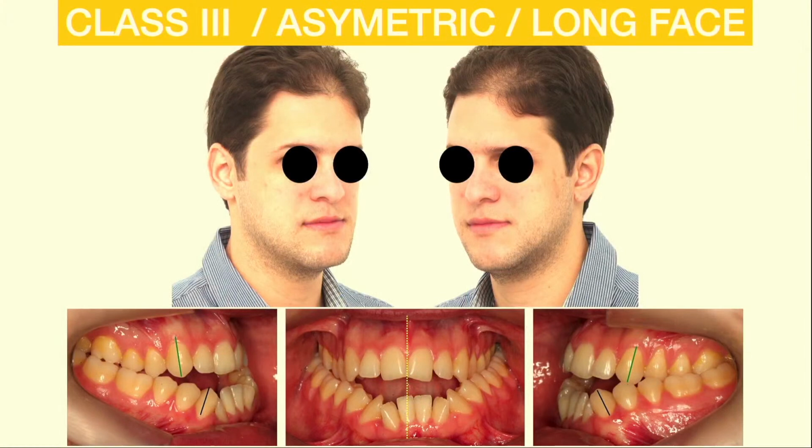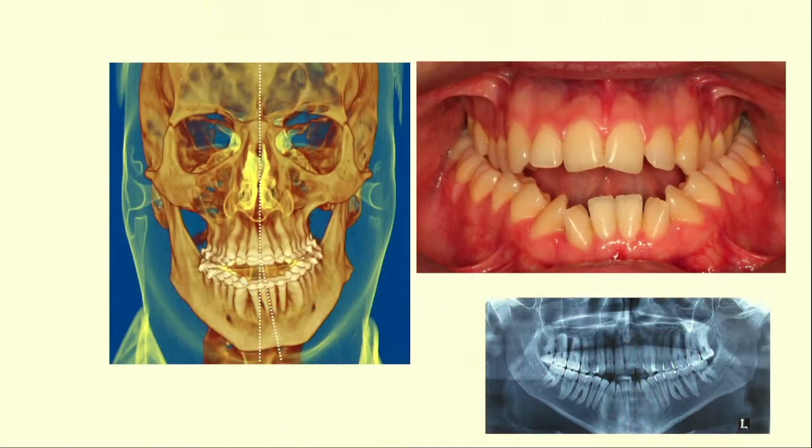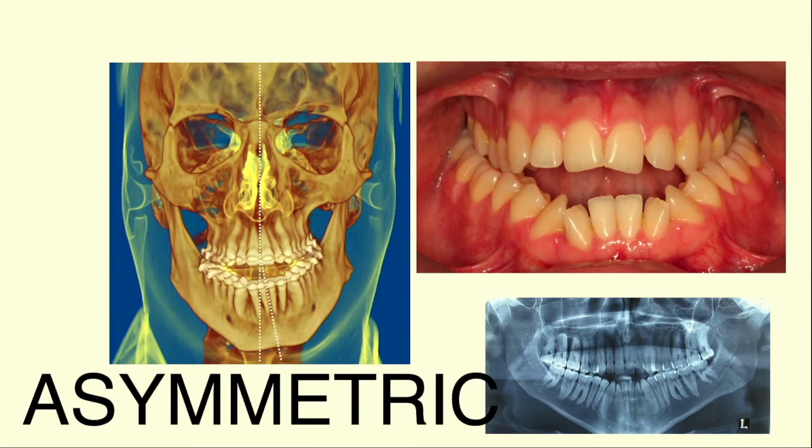And what about the transverse between upper and lower jaw? I have a total cross bite in this patient. And I have to understand how much it means. And of course, this kind of face with this kind of malocclusion, I will propose for this patient orthodontic surgery to correct everything. So these are all the steps that we are going to explain here, because we are going to trace all this planning in this patient, okay?